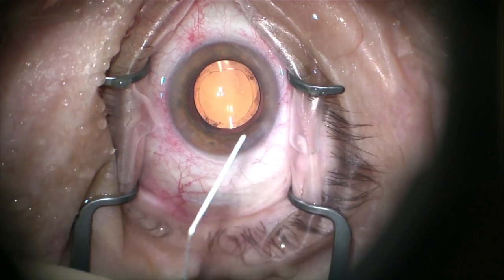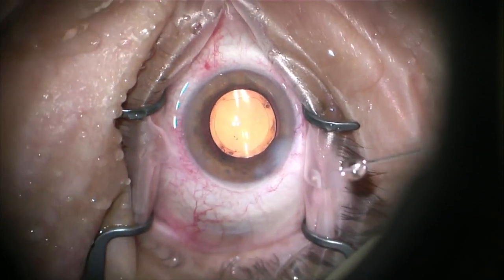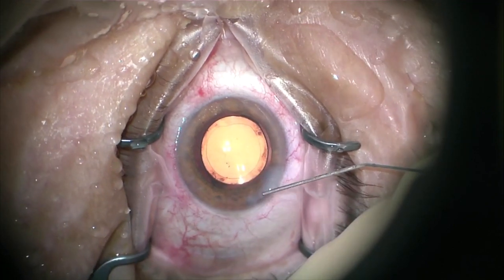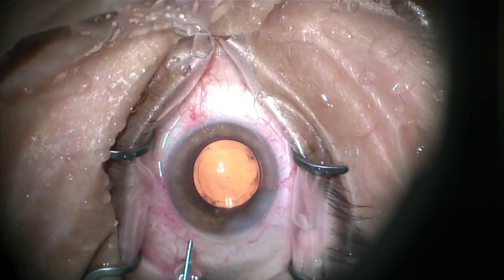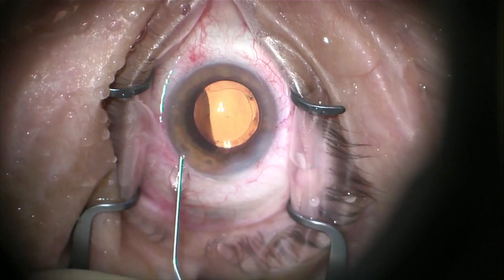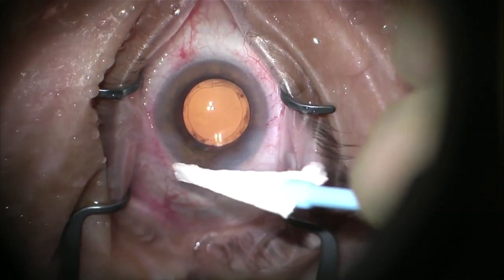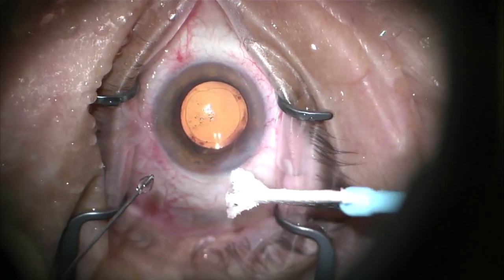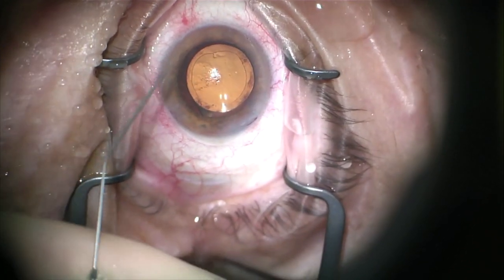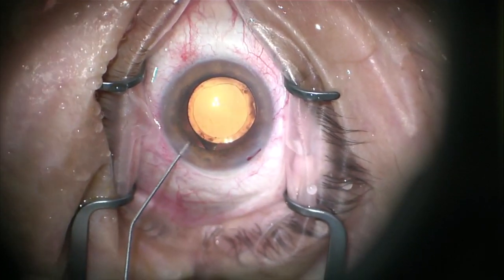When we hydrate the wounds, we want to take the inner edge and the outer edge of the wound, divide them in half, and your cannula goes right in the middle — right between the two, the distance from the inner to the outer. True for your main wound, true for your paracentesis wound. I'll do a little dirty burp on the main wound — so if there's a little leaflet folding back and holding the wound open, it pushes that back in and seals it. Most of the time you can get away with only hydrating half of the paracentesis wound as long as you get good edema coming around. I keep my cannula in hand so I can check the pressure and lower it a little bit — using the cannula and not the tip of a Weck-Cel, I think that's better. My partner and I both use intracameral antibiotics — that was what was at the end.